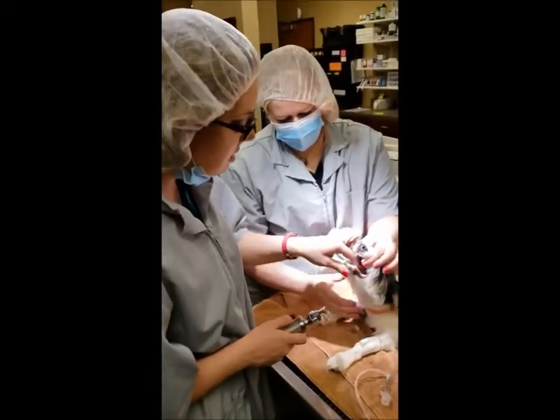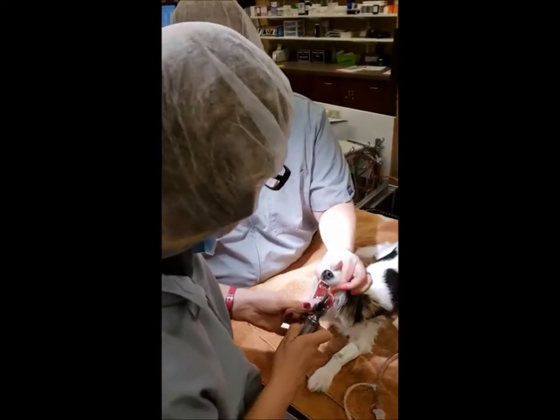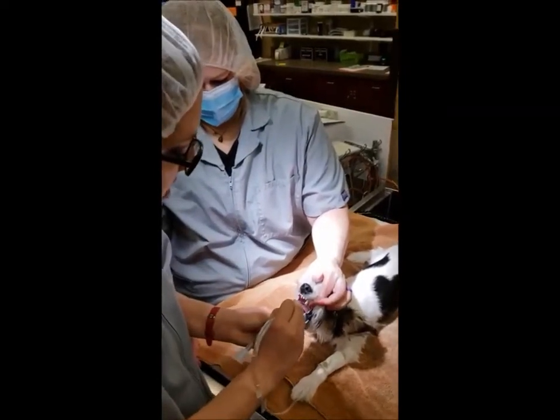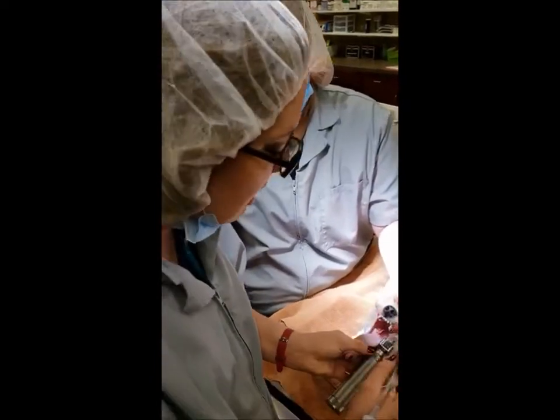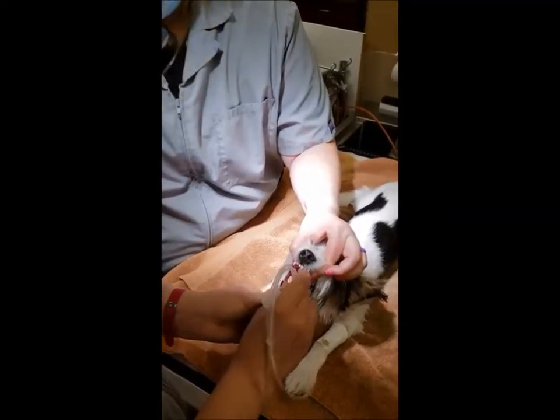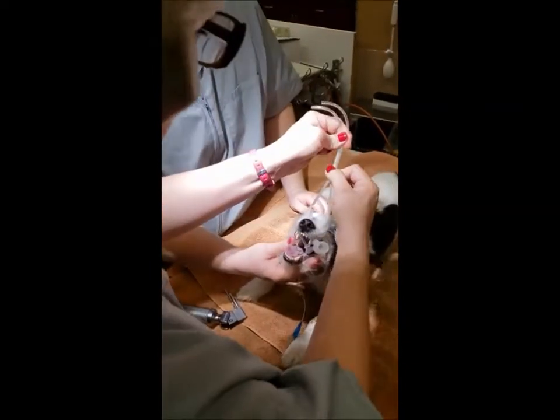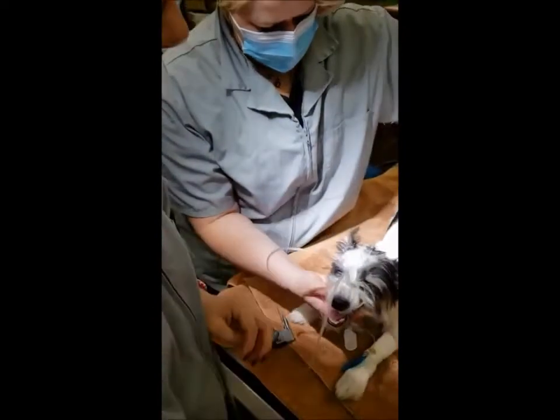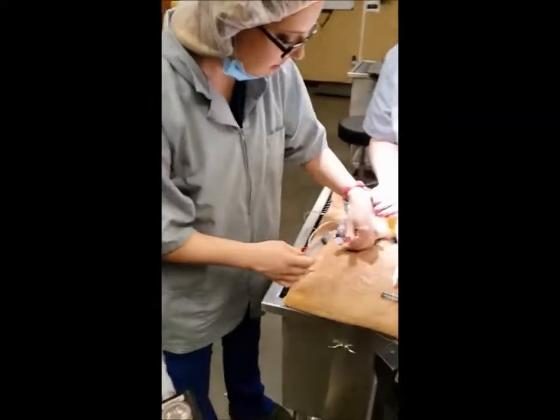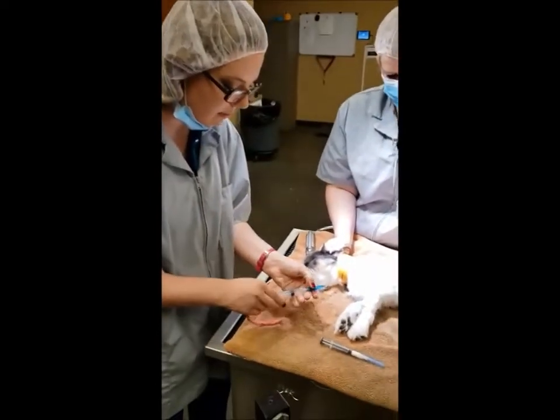Okay, I'm going to use a laryngoscope to intubate him. So I'm going to grab his tongue and I'm going to place the speculum in the mouth, and I'm going to use the speculum to open up the epiglottis so I can see the arytenoids, and I'll just go ahead and place the tube in his trachea. You want to be gentle so that you do not damage the trachea, and then I'm going to secure his ET tube with this. I'm going to inflate the cuff. So I'm going to use a syringe to put some air in the cuff.